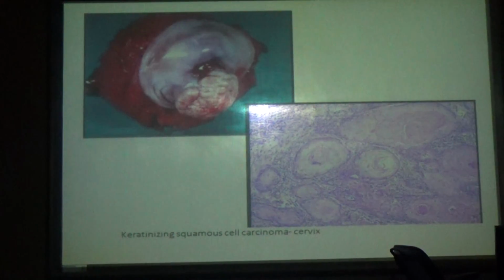Now I am going to the cervix. This is the cervical os. From here the cervix starts, then here the uterus. This is the cervical os. What you are seeing is the cervical growth over here, which is protruding outside from the cervical area.